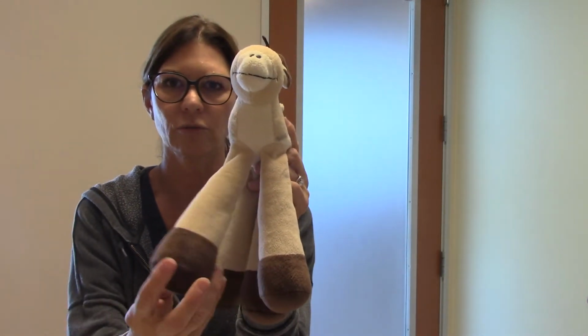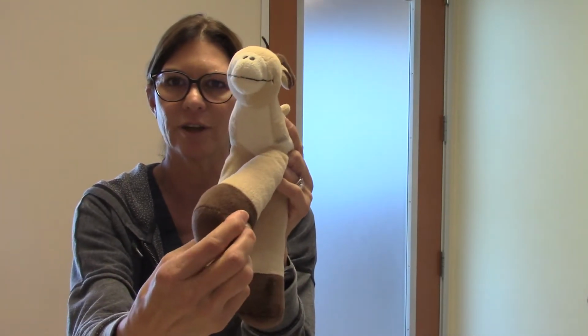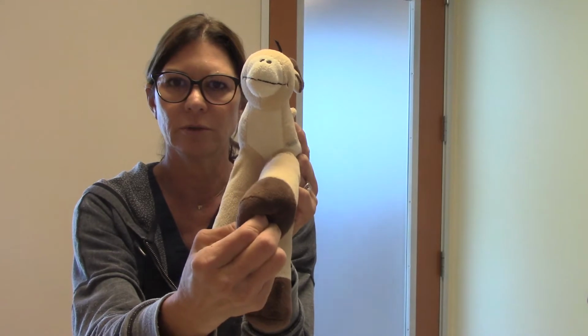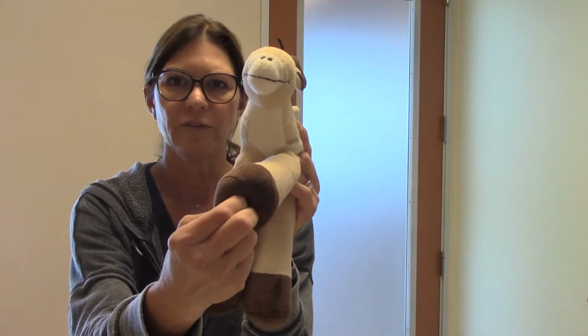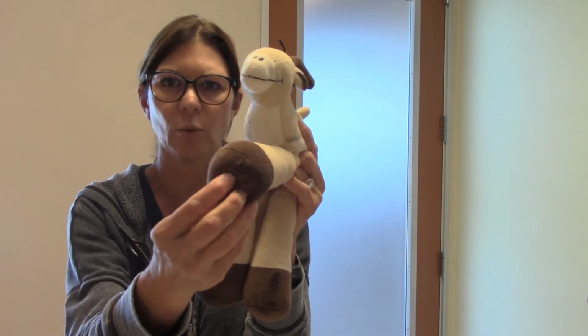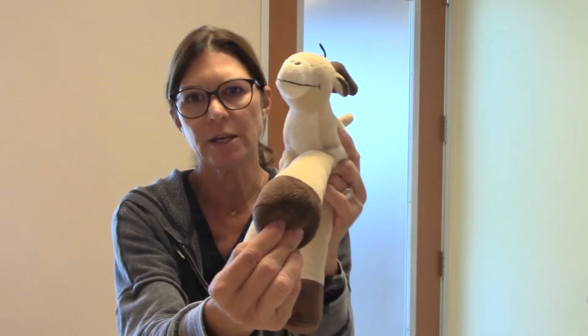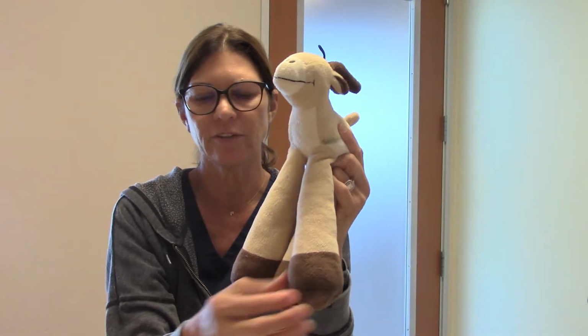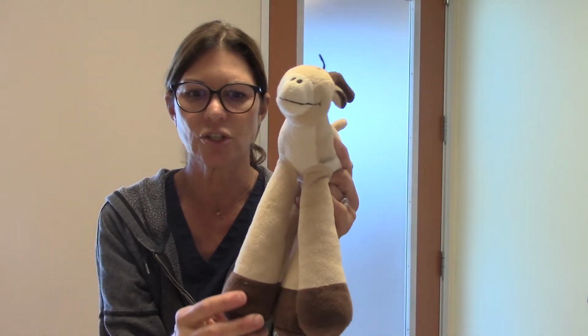The pedal withdrawal reflex is when you, that one has a squeaker in it, so I won't do that one. You have to use a little bit of pressure, but if you press on that, they should withdraw their leg, and that is called the pedal withdrawal reflex. When pressure is applied, these reflexes start to diminish as they go into a greater state of anesthesia.